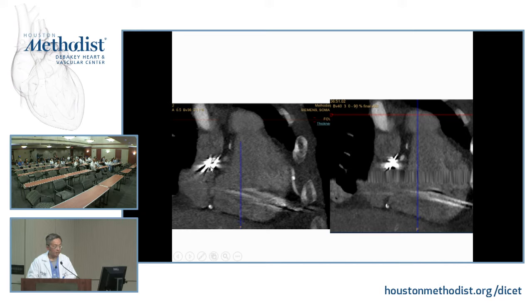So this is the beam hardening artifact he was talking about, okay? Because the X-ray photons have different energies, for instance here, it goes through very dense objects, so those with lower energy don't go through this, and therefore give you a shadow like this, okay? So that's a beam hardening artifact. Okay, what else? There's a stitch artifact. Stitch artifact.